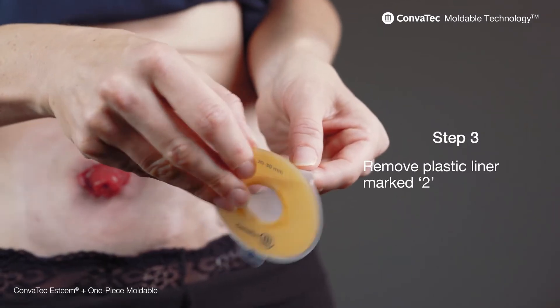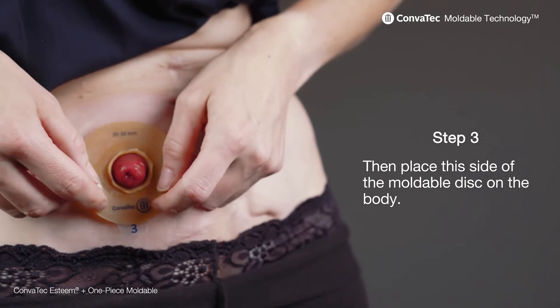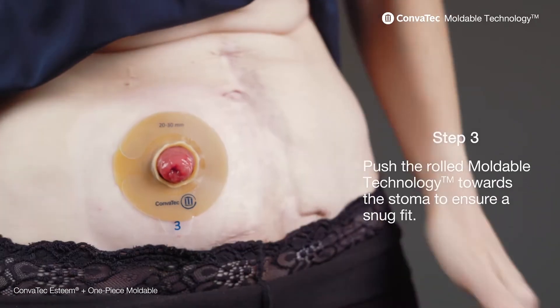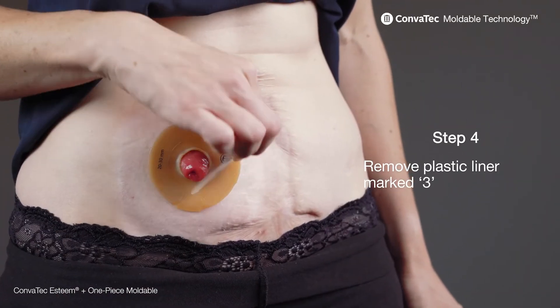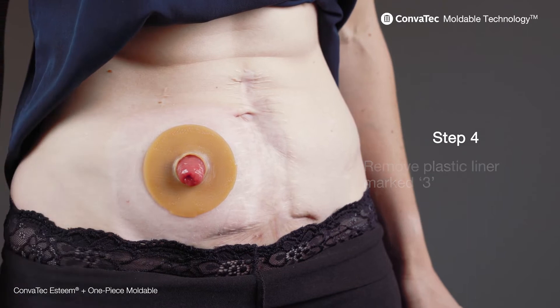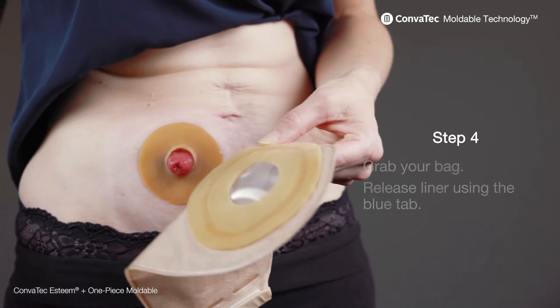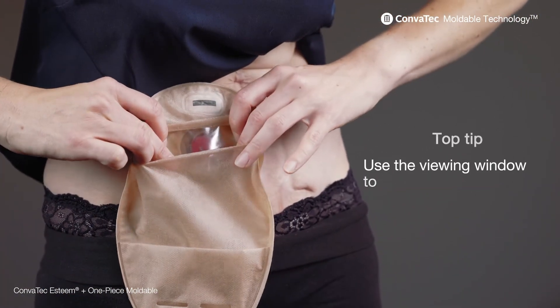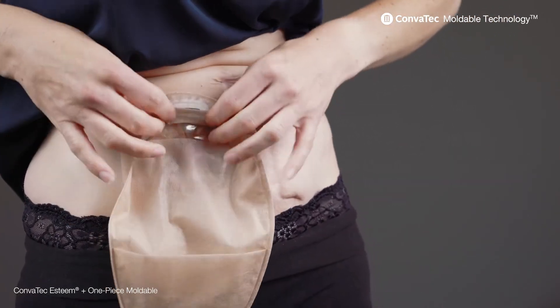Step three: remove the plastic liner marked two, then place this side of the mouldable disc on the body. Push the rolled mouldable technology towards the stoma to ensure a snug fit. Then your final step: remove plastic liner marked three, grab your bag, release the liner using the blue tab, then attach the bag to the mouldable disc. A tip for applying it — use the viewing window to make application easier. And you're done.